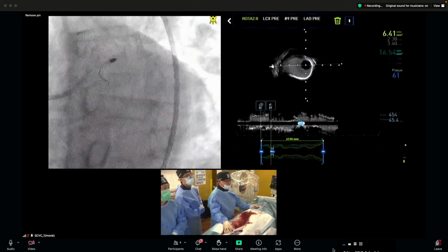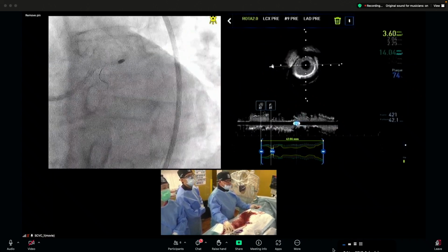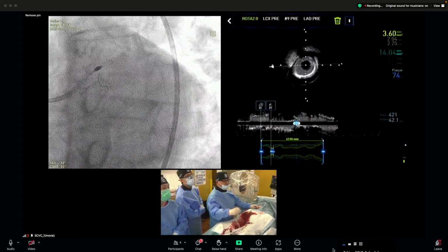To be sure, you're using the 2.0 burr again? I think it's 2.25. 2.25. Wow, really?